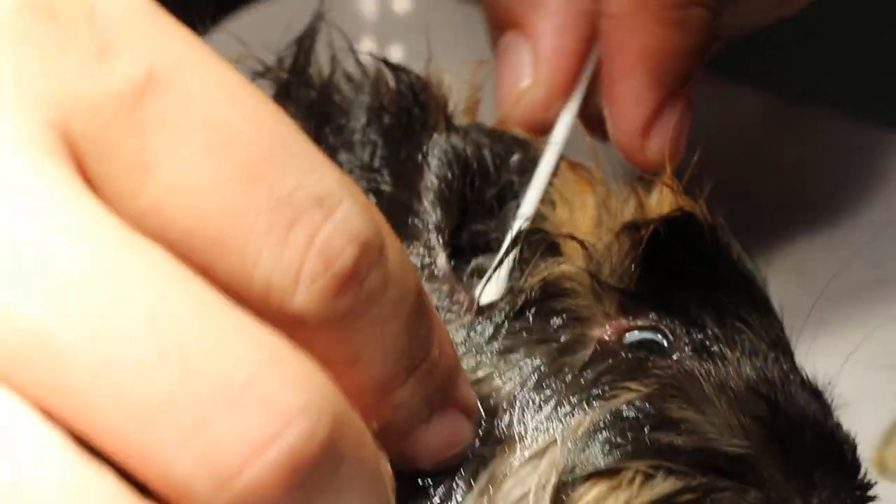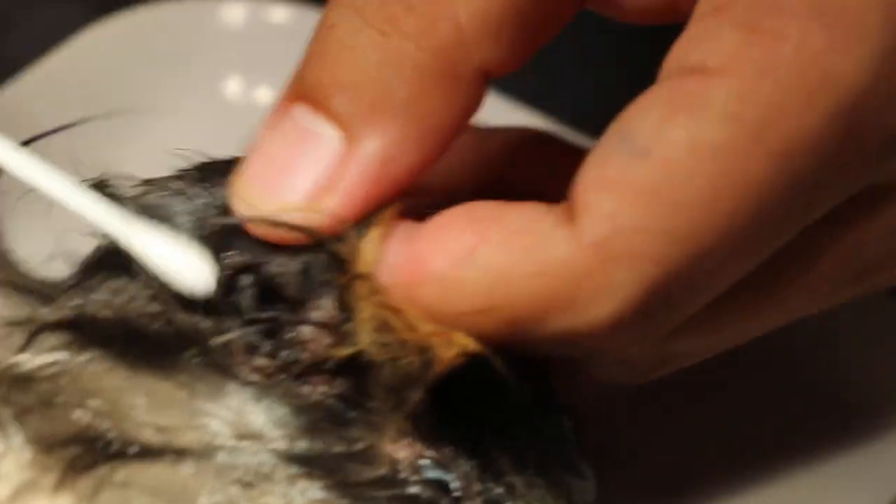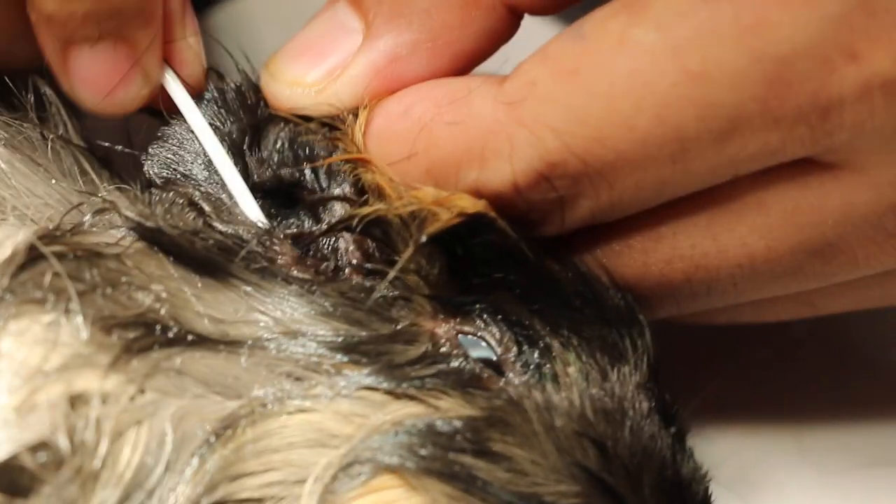How dirty is it? Not so dirty — but it's still black. You can see it's still black, still black inside. It's quite deep in there. Ear infection can cause head tilt, or traumatic injury. It's waking up already — some gas again. Still very dirty.